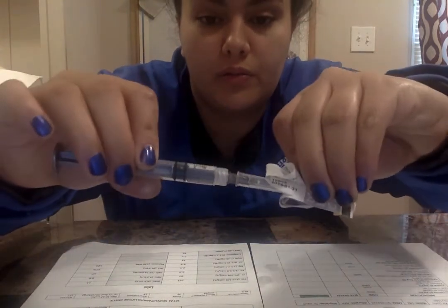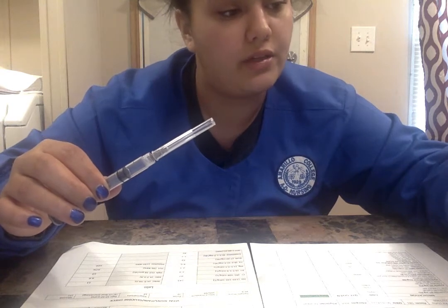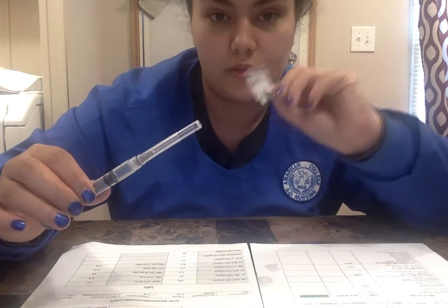And we're going to twist it on. And this is a 22 gauge. It is a 1.5 inch needle. This goes in the trash. This goes in the trash.